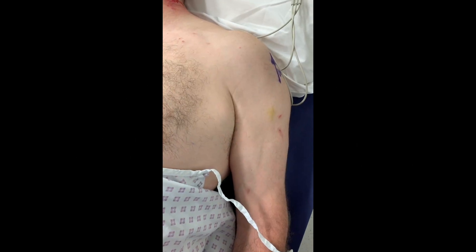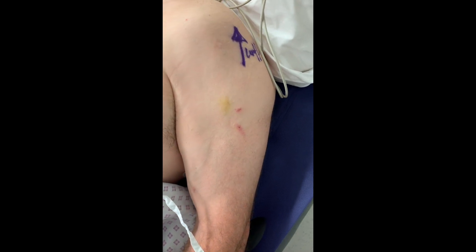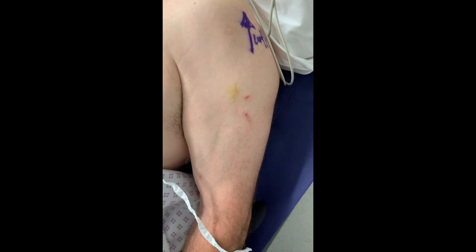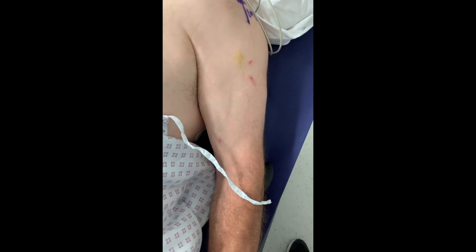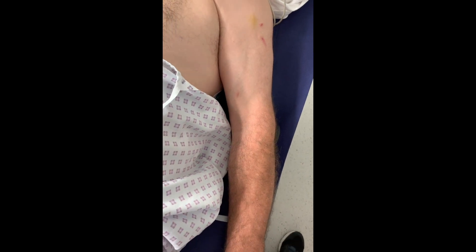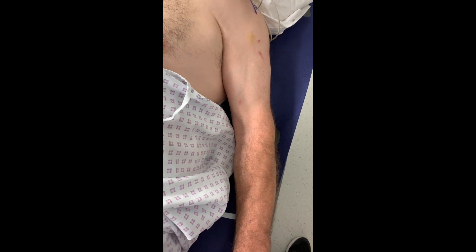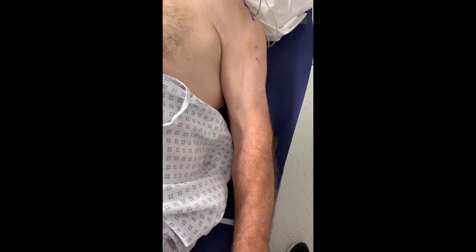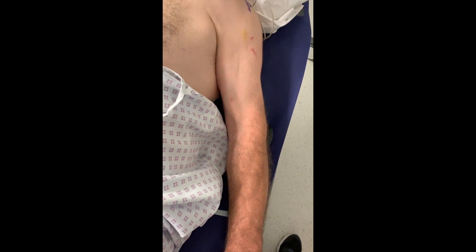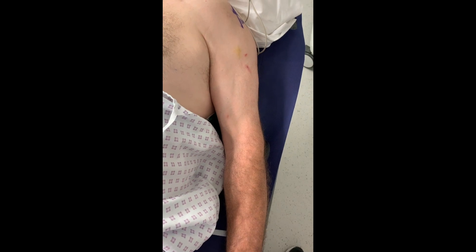Here we go — this is our lovely patient who has very kindly consented to this and to the block. We've used the butterfly probe to put the interscalene block in, and I'll pop the image on screen also with consent. Can you lift your arm for me? You're definitely trying to lift your arm — there we go. So we have a nice functional interscalene block sited with a butterfly probe, and we're going to pop into theater.